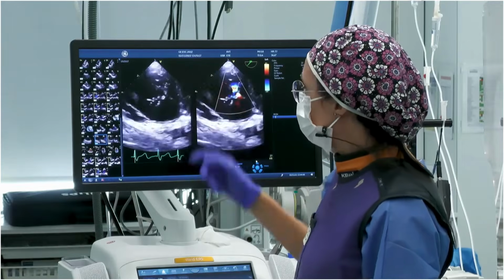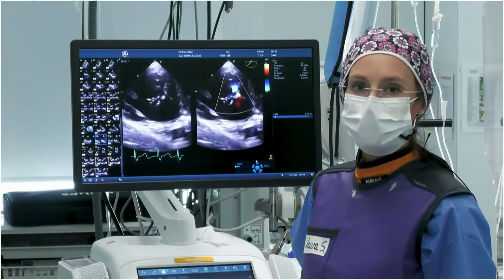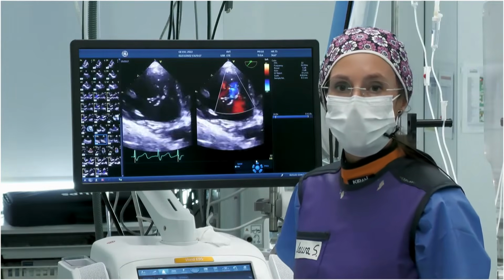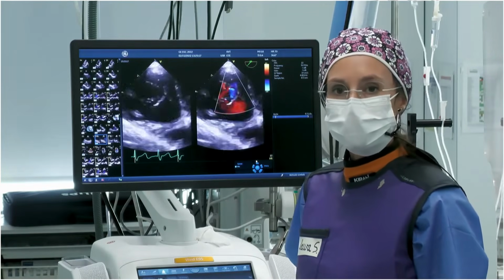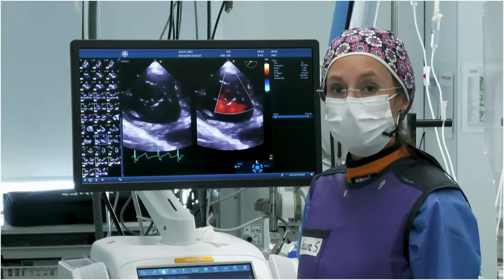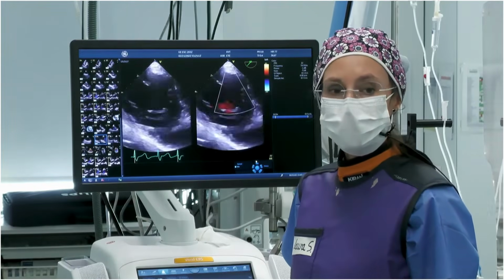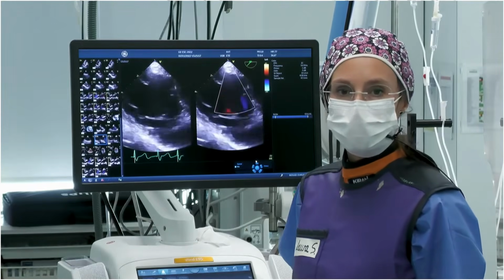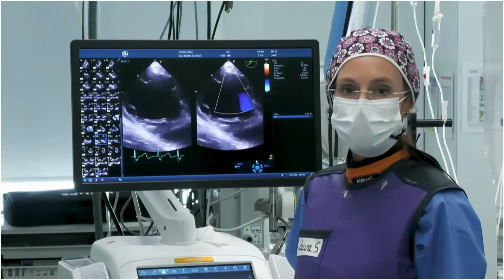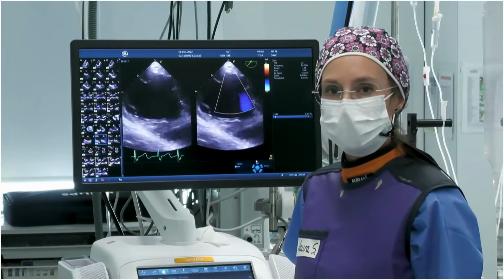P1 and P2. So in this case, with a big annulus, big gap, and a 4-leaflet tricuspid valve, we decided at the beginning to also scan the patient for an annuloplasty. But when we performed the CT scan, we found that the right coronary artery was too close to the annulus, so we reevaluated the patient for edge-to-edge therapy. And what we did is that we admitted the patient 2 days before the intervention. We gave some diuretics and we repeated the echocardiography, and we observed that the amount of the TR and also the gap was smaller than in the screening echo.